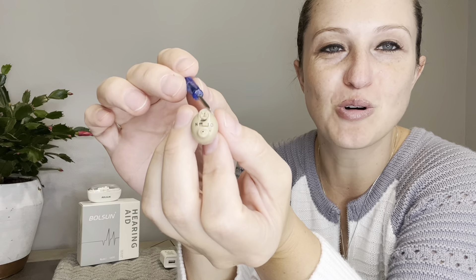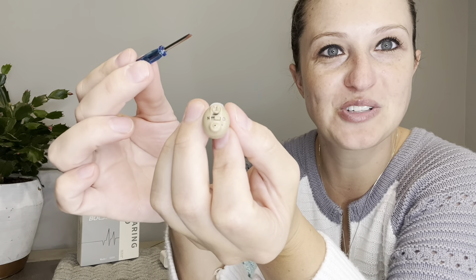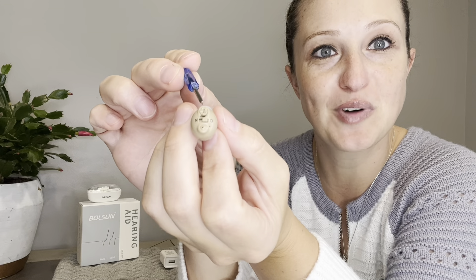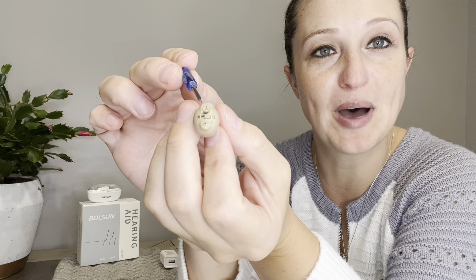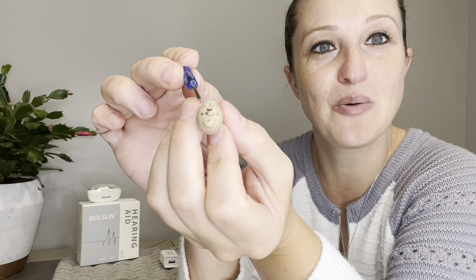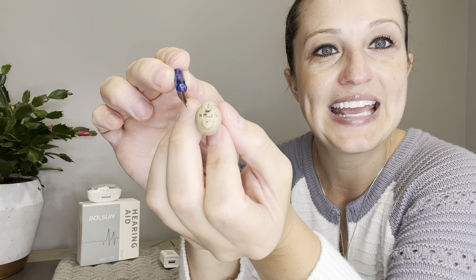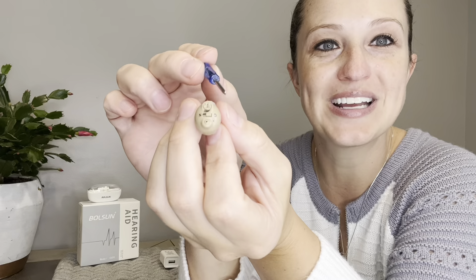Now let's take a look at the controls on our actual hearing aid. We're going to use our handy screwdriver that's provided to adjust the volume. You want to turn it right, which is clockwise, to turn the volume up, and turn it left, counterclockwise, to turn the volume down. Then we have an O and an N — N is on, O is off.